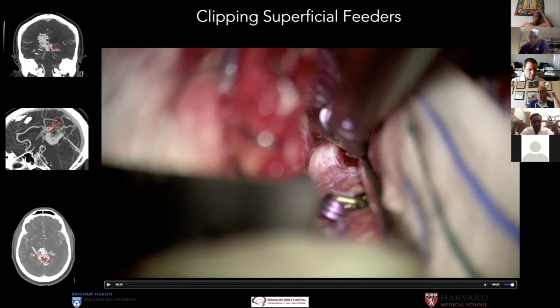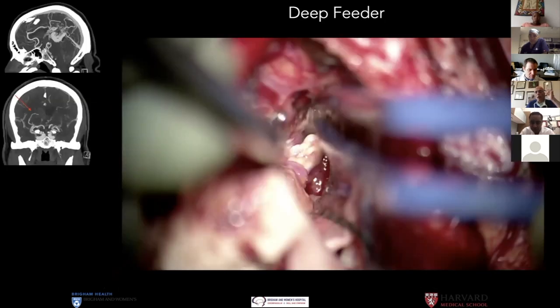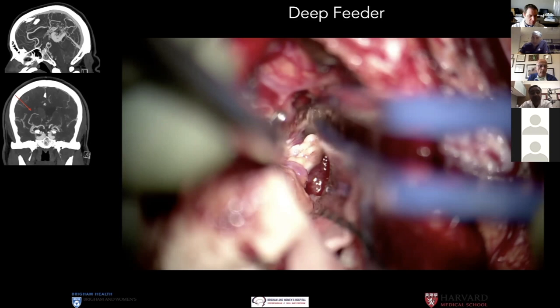And as you accustom your brain to it, you'll just see it. You'll just see it. So this, I'll point it out. And the arteries will sometimes have a grayish appearance on their surface due to the hypertrophy from constantly working, pushing blood, right? So this is the deep feeder I mentioned coming up from anterior circulation coming into the ventricle.